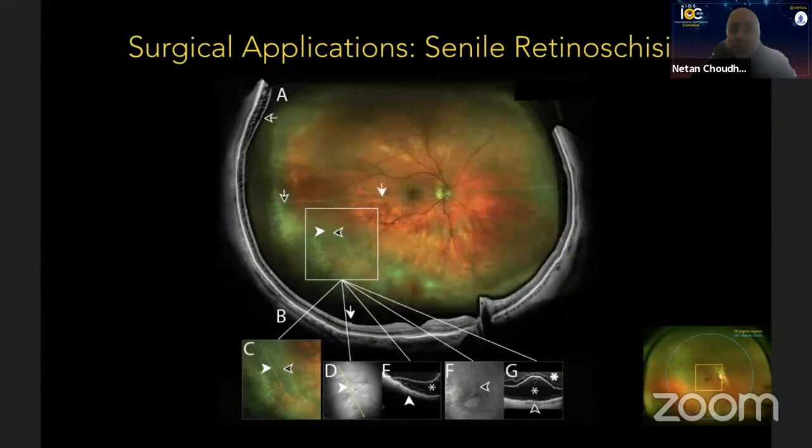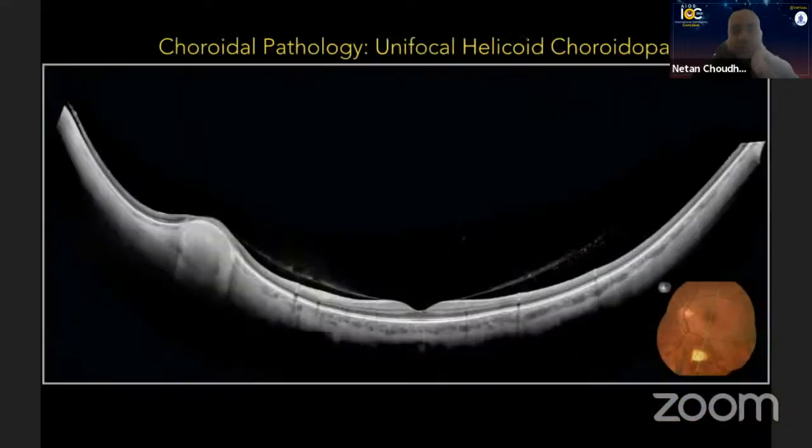The surgical applications, of course, continue: differentiating retinal schisis from retinal detachments. A lot of the pseudo-color imaging has created some artifact and always raised the question of, am I looking at something that's pathologic or is it normal? Now being able to drag and drop a line scan out there and being able to see a schisis or a detachment or peripheral cystoid degeneration or a normal retina helps to differentiate all that.